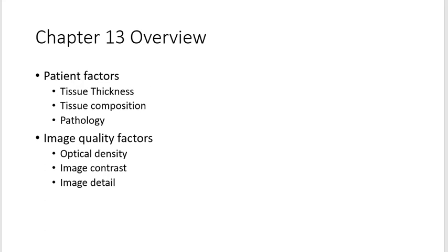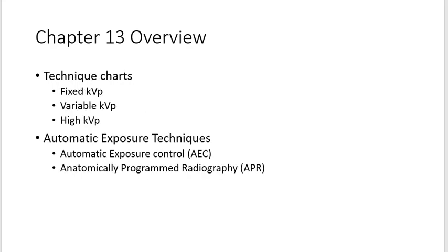We're going to talk about image quality factors: optical density, image contrast, and image detail. Remember, we've got two different things in detail. We've got sharpness of recorded detail, and we've got visibility of recorded detail. Image detail is really your sharpness of recorded detail.